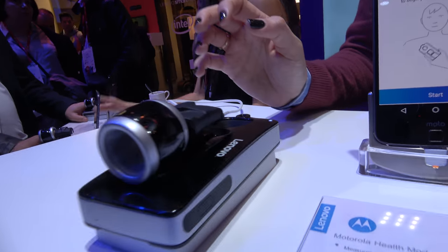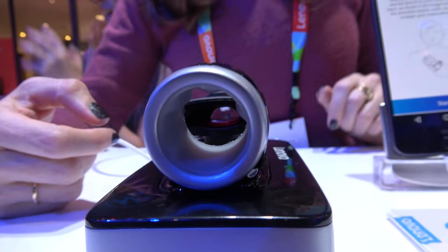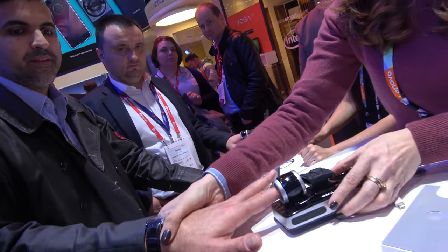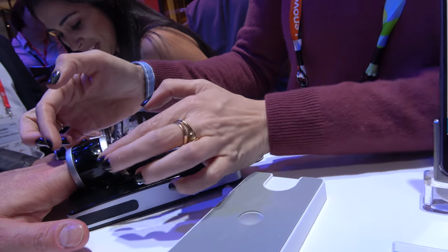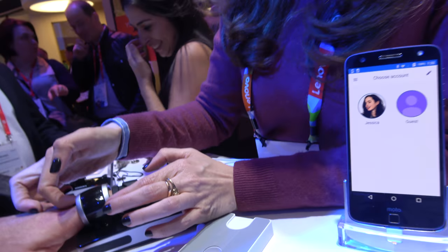How does it work with this finger here? You put your left index finger into the device and it inflates around your finger. So for demo purposes, Fabio is going to demonstrate it. You put your left index finger into the device and it inflates around your finger.